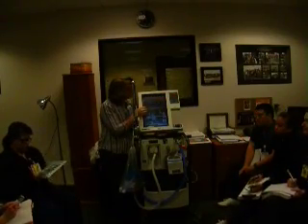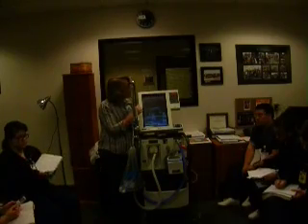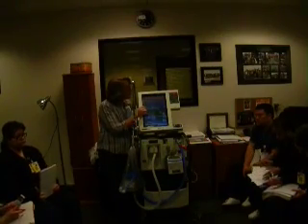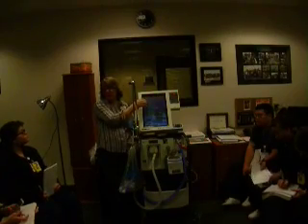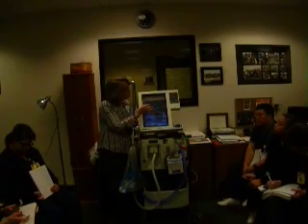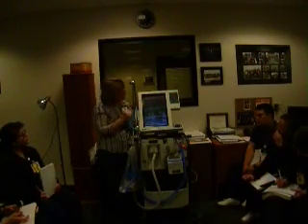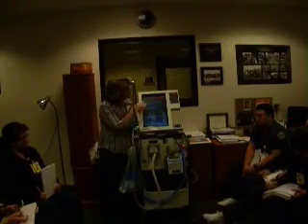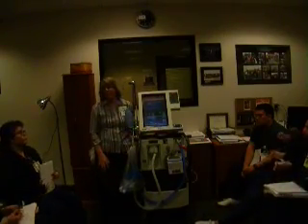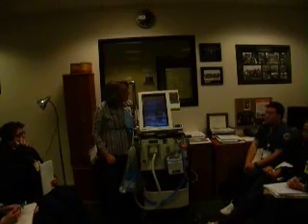And if we go over to the little thing that looks like a clipboard, you'll see that tells you about your O2 percentage. That's not really one you'll use very often. Then you have one that has a picture of an alarm with a question mark. That's where you can go back in and see what alarms have gone off, which sometimes is useful if you came back in the room and it had been silenced, you could see which one had been going off. Then this next one is volume. Oh, see here, minute ventilation, that's a yellow one. I thought that was a yellow one. You could see where it came up. And then this next screen will tell you some other screens, diagnostic screens. We rarely use those, but it is there in case you need to go back in. You could look and see when SSTs were done, diagnostic codes and things like that.